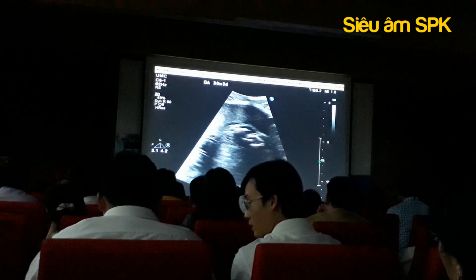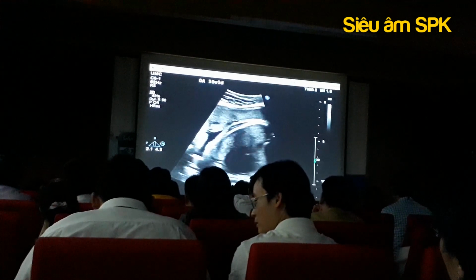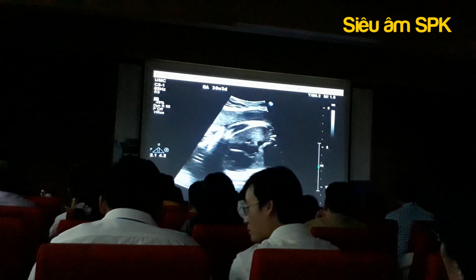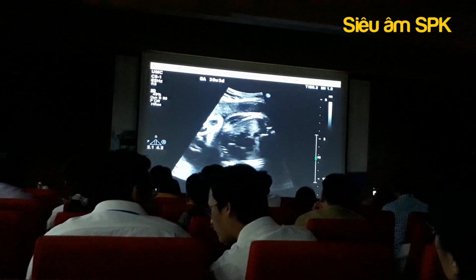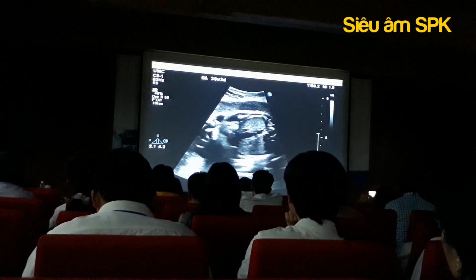As soon as we stop, the baby will roll over. Okay.